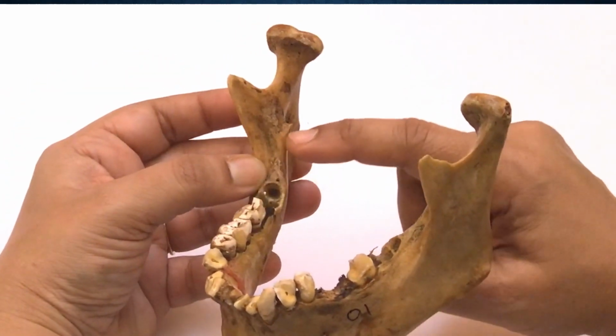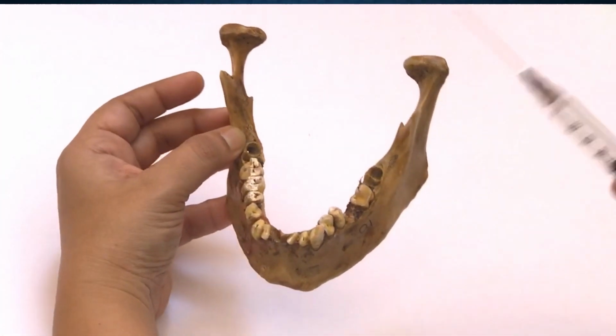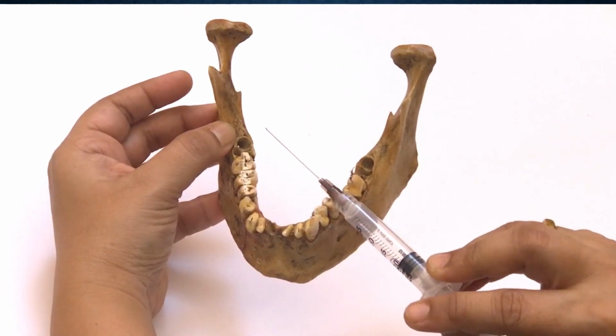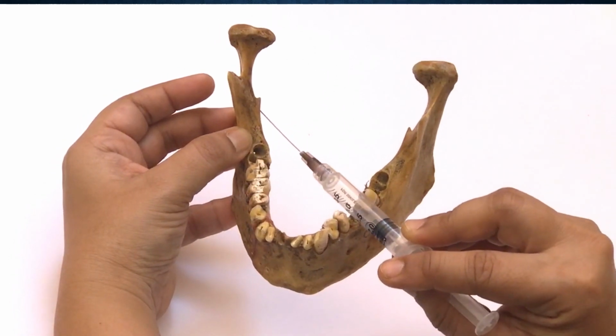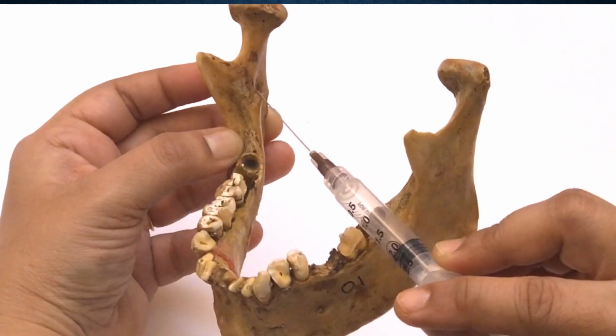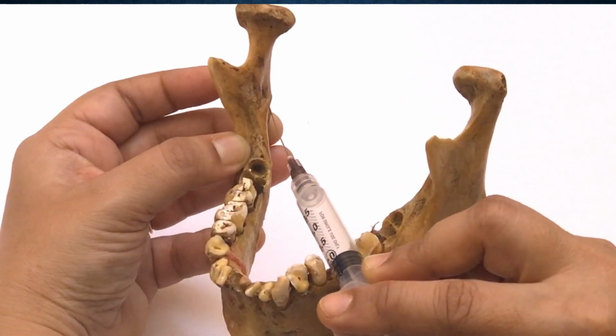With our finger in this position, we will reach the target area, which is the mandibular foramen on the medial surface of the ramus. Now, taking our needle from the opposite side premolar, we bisect the fingernail that is present on the coronoid notch and go exactly till we reach bony resistance on the medial surface of the ramus of the mandible. This is as close to the mandibular foramen as possible.